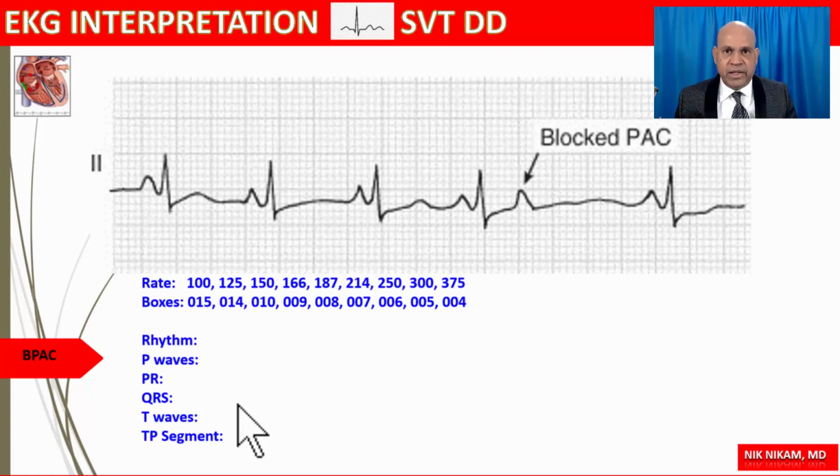I will go over this and show you the importance and significance of this underlying fundamental foundation that is going to help you decipher any type of supraventricular tachyarrhythmia and come to a logical conclusion, and then make a decision on what is the acute treatment and what are the drugs of choice in the long run. Okay, let's look at this, we have here 1, 2, 3 major boxes.